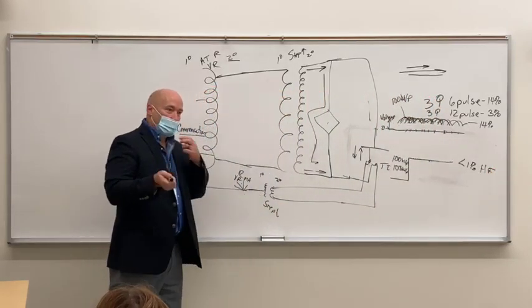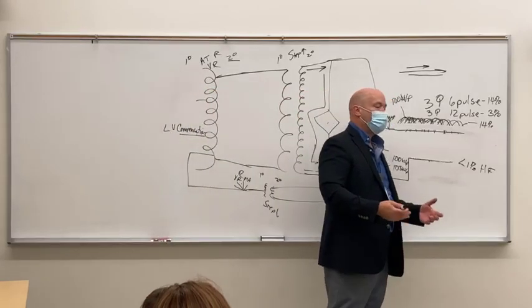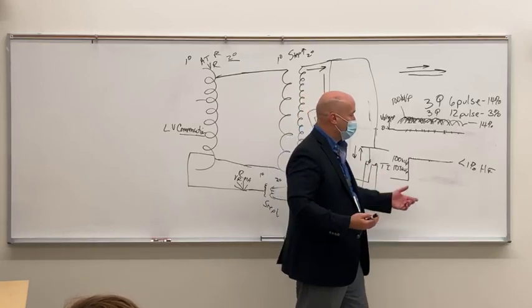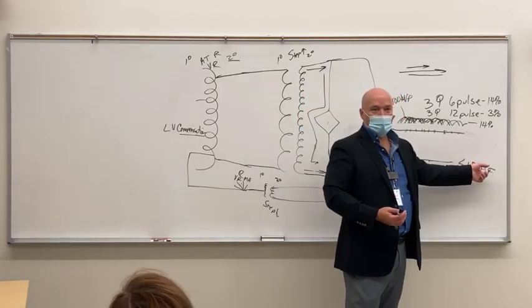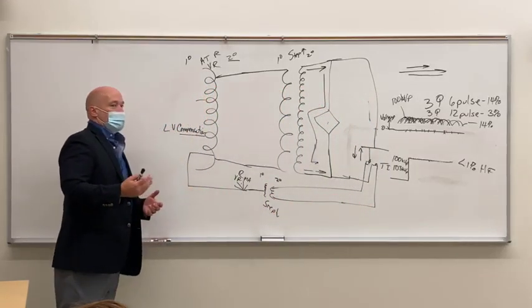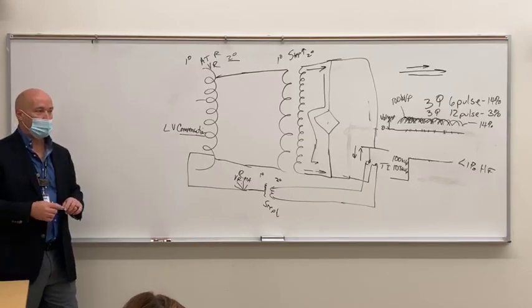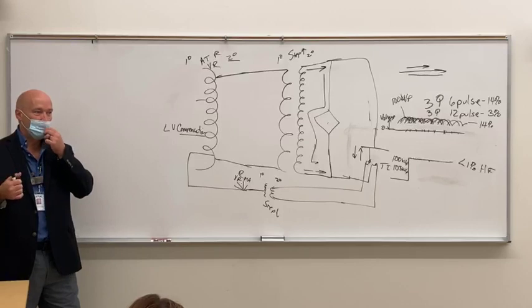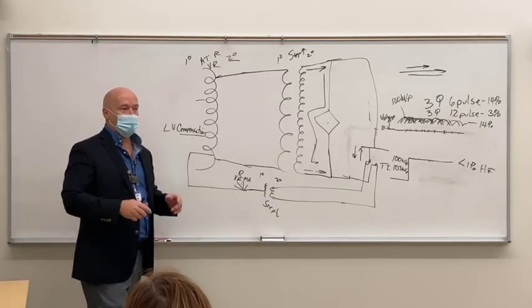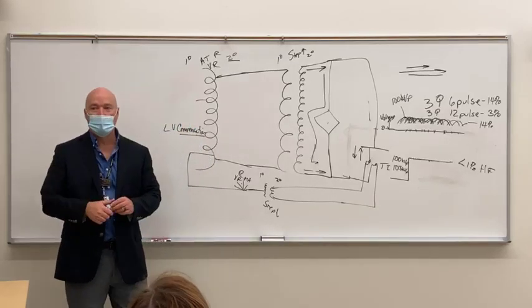Okay? Every new machine that you see that you'll get probably within your career, again, unless you're working at a small clinic somewhere in the middle of nowhere, you're most likely going to be looking at a high frequency system. Okay? So the high frequency system, you can tell audibly when you're working with a high frequency system. When you make your exposure, you should hear a beep coming out of your console, but somewhere in the room, and if it's up in the ceiling, it may be hard to hear, but listen really, really carefully.